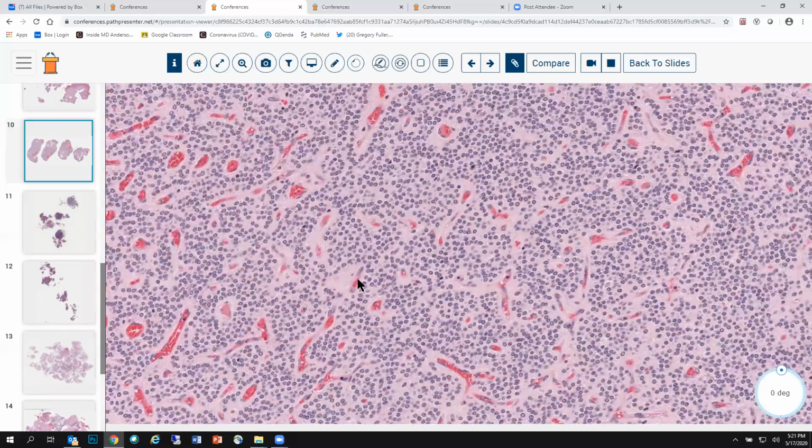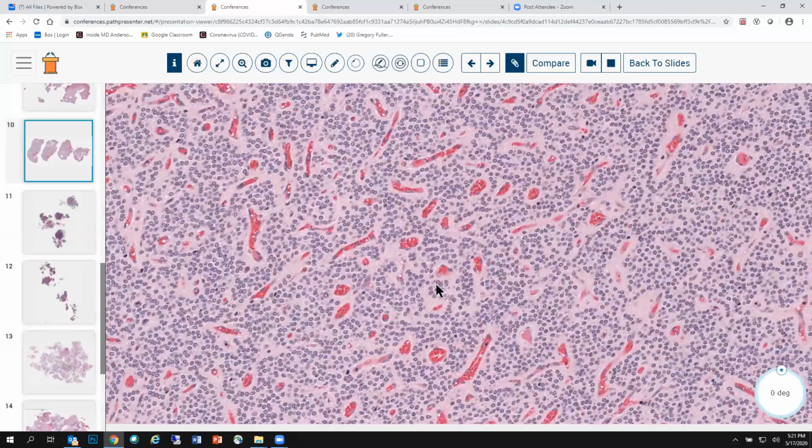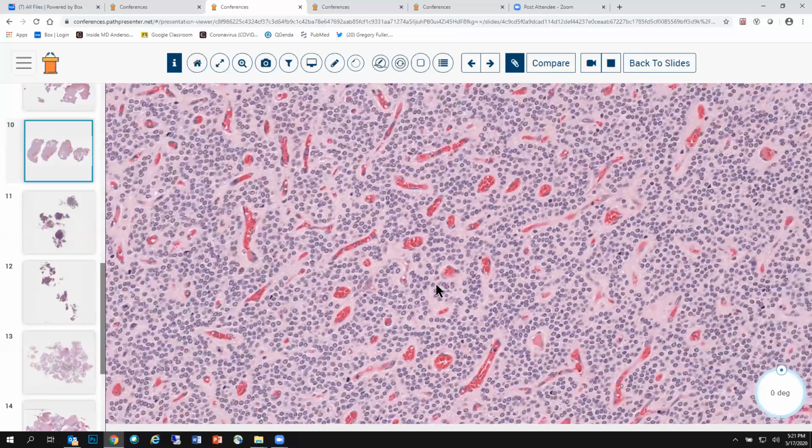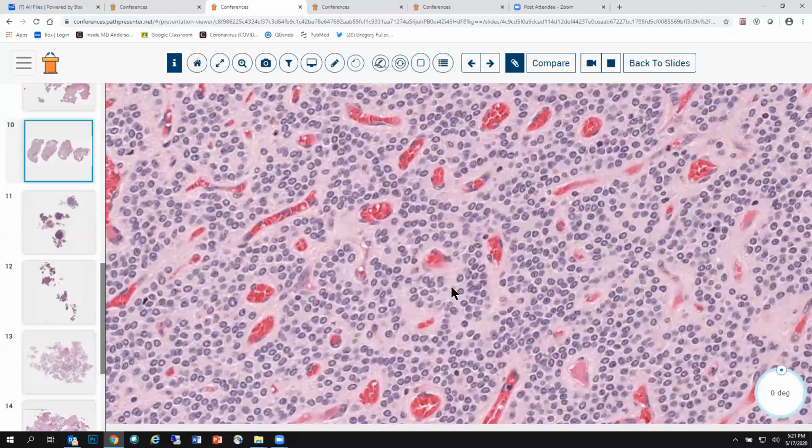They have this delicate branching, so-called chicken wire vasculature. They can have microcalcifications. You might be thinking oligo, all right? But in this particular case, how could you separate it? 2 ways to separate this tumor. Number 1, it's in the ventricle. This is central neurocytoma. And number 2, if you even suspect it, you simply run GFAP and synaptophysin.